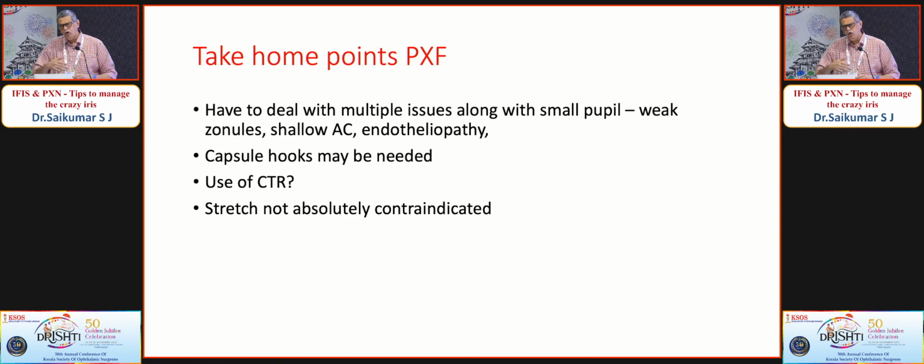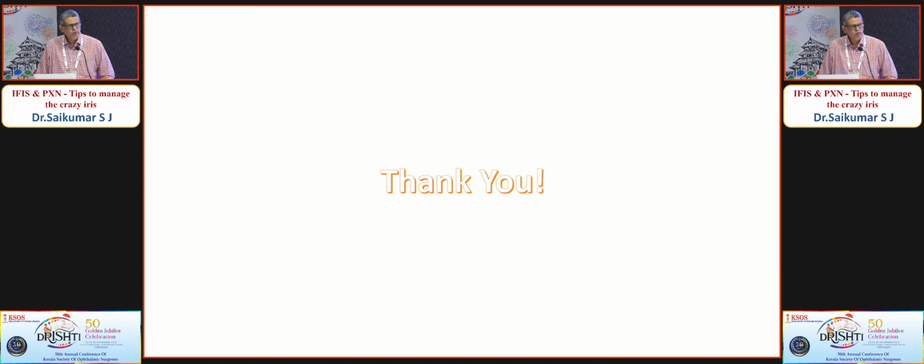I found that over a period of time, it did not have much effect, because many of the pseudo-exfoliations I did 10 years back, 15 years back, with all these things, the entire bag, the iris, the IOL, the CTR, everything started falling down in some cases. And stretch pupilloplasty is not absolutely contraindicated in pseudo-exfoliation, unlike in a case of IFIS. Thank you for your kind attention, and thank you, Sinumol, for having me in this course.